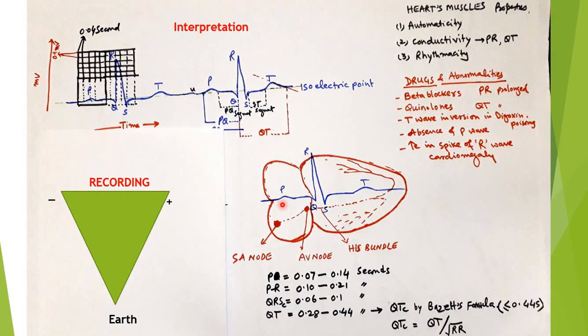seconds. So interpretation and recording of the electrocardiogram is very important, and this helps in determining certain heart abnormalities as well as drug toxicological manifestations.